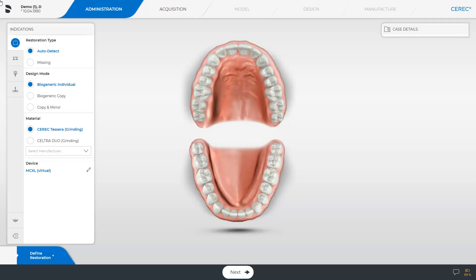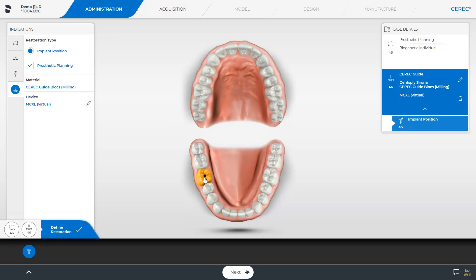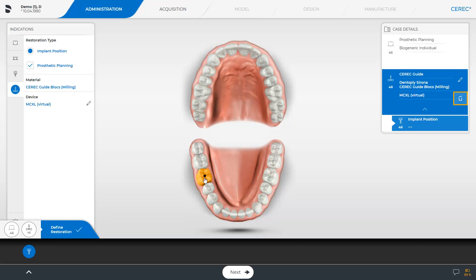We start in the administration phase and select the indication CEREC Guide. The checkmark for prosthetic planning is already checked under Restoration Type. Next, we click the appropriate tooth position on the odontogram. The Case Details window appears with information regarding the implant position, the block, and the selected milling unit. The selections can be modified by clicking on the pencil symbol, and the case can be discarded by clicking on the recycling bin.